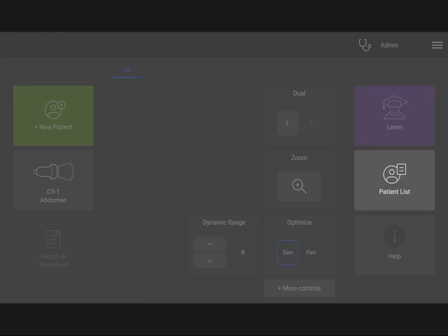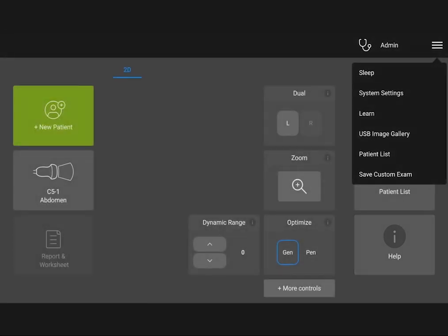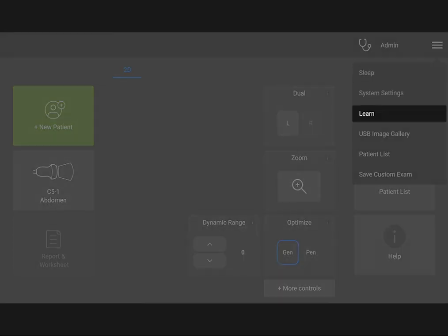Access previous studies through the patient list. For help, go to Onboard Help. From the menu, you can also access system settings as well as other features.